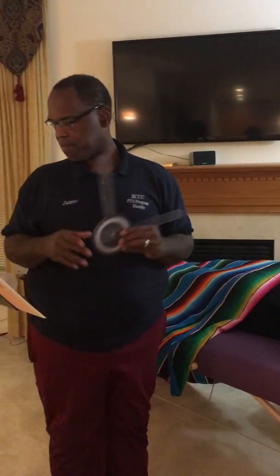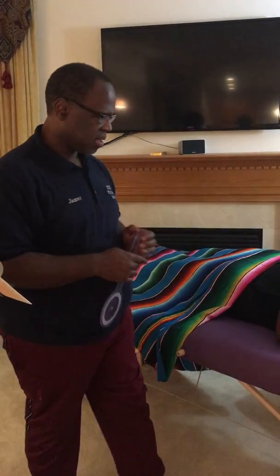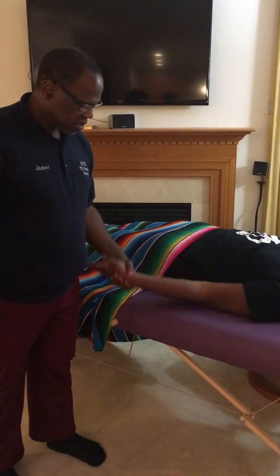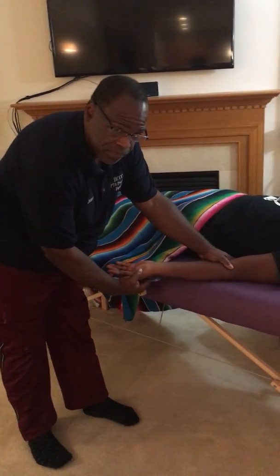All right, let's look at Roman numeral number 2, negative measurements. A measurement is recorded as negative if that motion ends, and it says here, cannot go any farther before it reaches the neutral or 0 starting position. Let's look at the elbow. This is 0 degrees of elbow extension.